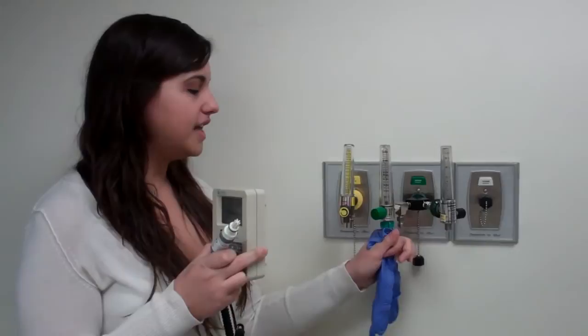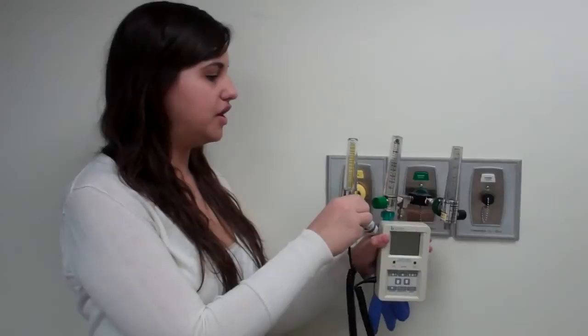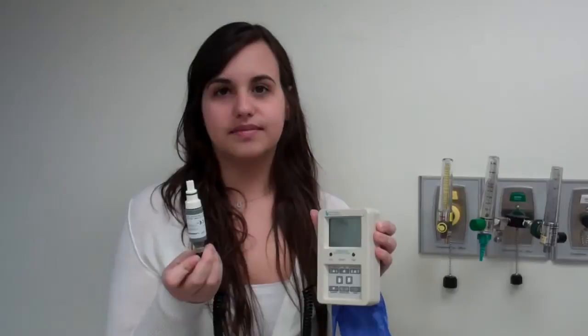You attach a glove to it, you put it to flush in order to get 100%, and you put this in here, and you wait for it to get to 100%. Once you get 100%, you're going to put it up just to the air and get it back down to 21%, and that would be a two point calibration.